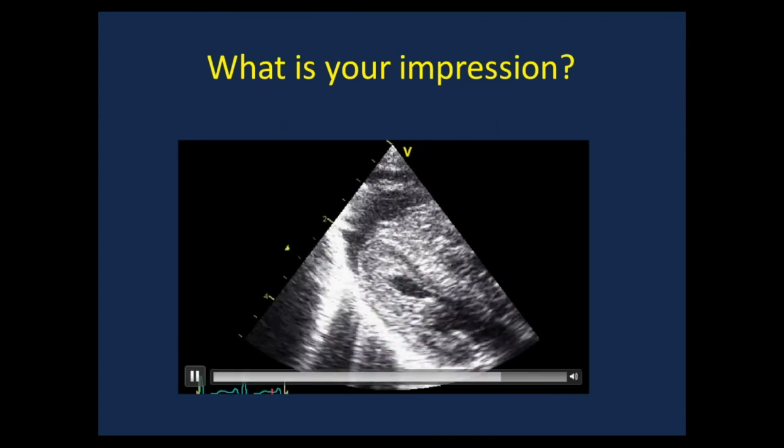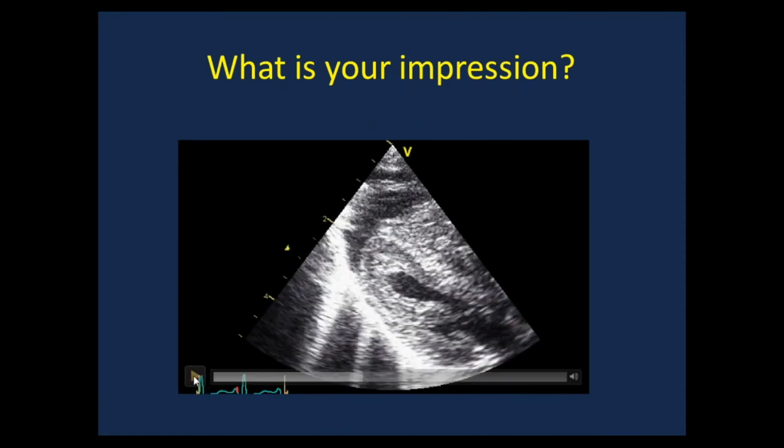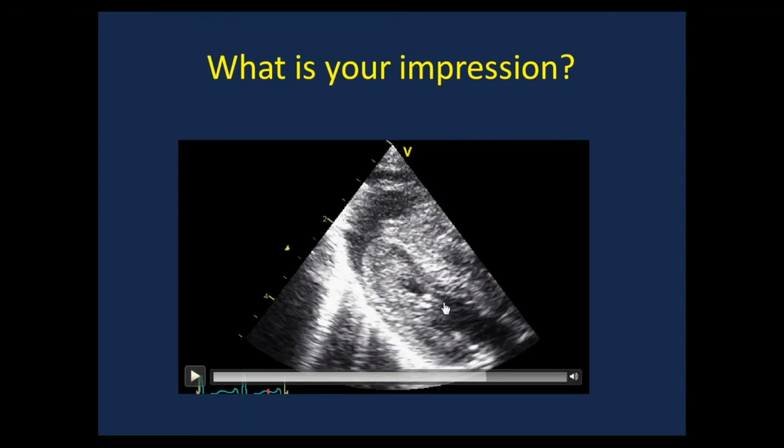And there's the parasternal long axis view. As you can see, at the end of diastole and the end of systole, there's nothing left over inside the ventricle. So that's severe underfilling, and it should be very clear at the end of systole, because if you have underfilling in both systole and diastole, that's actually a picture of a dying or died infant. There should be some filling in diastole, but at the end of systole, the heart is trying to compensate by evacuating almost the entire volume inside the ventricle. And you have some pericardial effusion. That's part of the third space.